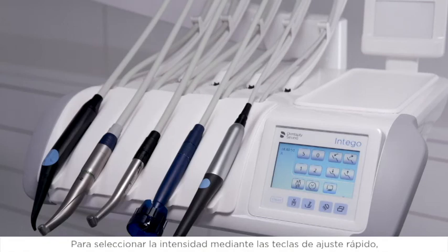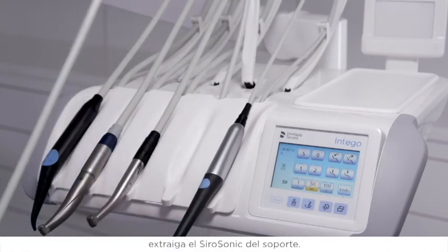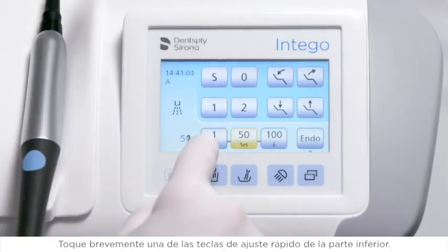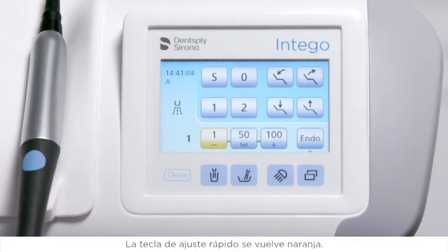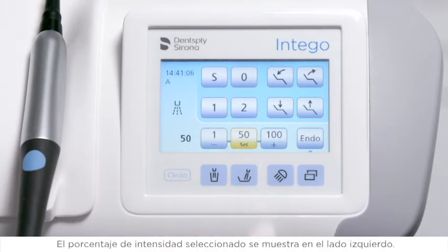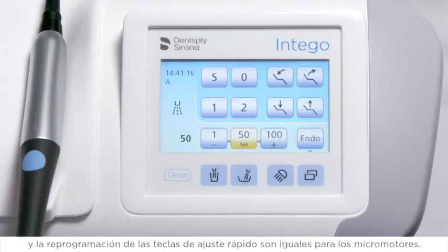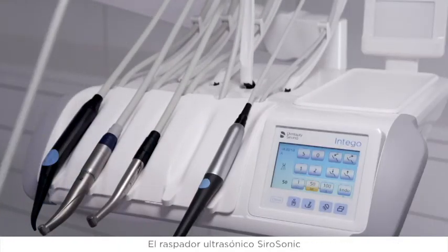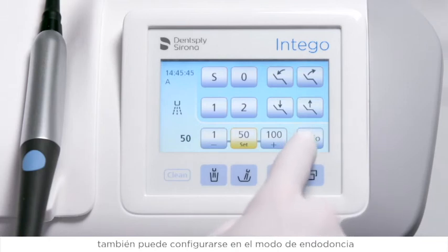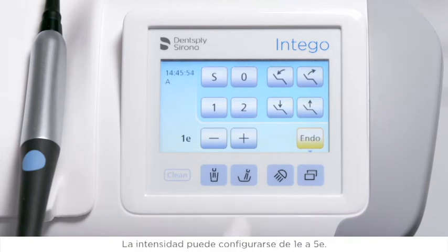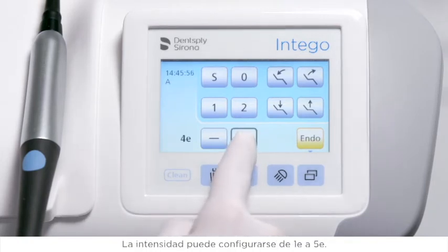To select the intensity using the quick setting keys, remove the serosonic from the holder and touch one of the quick setting keys in the bottom line briefly. The quick setting key is highlighted orange, and the selected intensity percentage is displayed on the left side. Setting intermediate intensities and reprogramming the quick setting keys is analog to micromotors. The serosonic ultrasonic scaler can also be set to an endodontic mode for activation of irrigation solutions in the root canal; the intensity can be set from 1E to 5E.